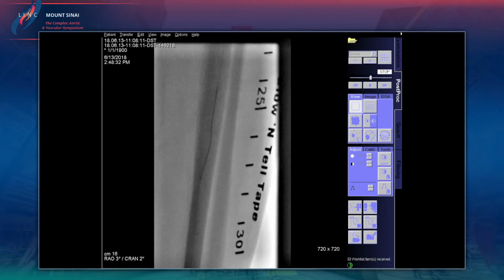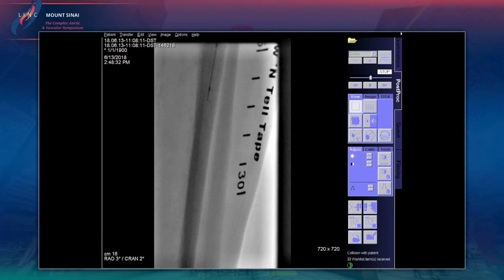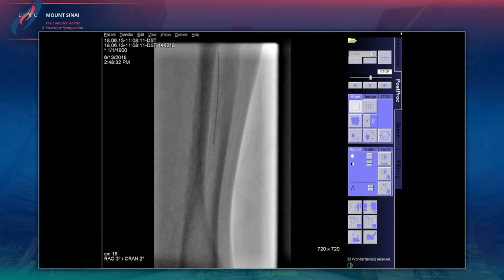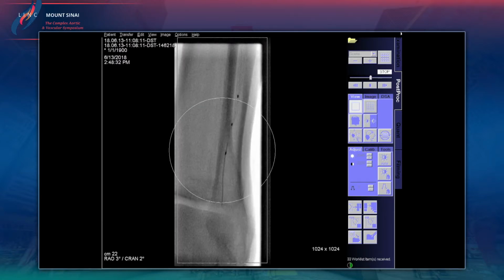And in terms of therapy? Well, I wish we had DCBs for this because this is clearly one of his problems, but I would probably do atherectomy and angioplasty. It's interesting, that stent down at the lower leg there, the distal third. All the surgeons who've done fasciotomies know that this area right where you are now with the wire is where all of these muscles are very tightly constricted by the fascial compartments, and it's an area where you'd expect to see stent fractures or crushing of the stent.